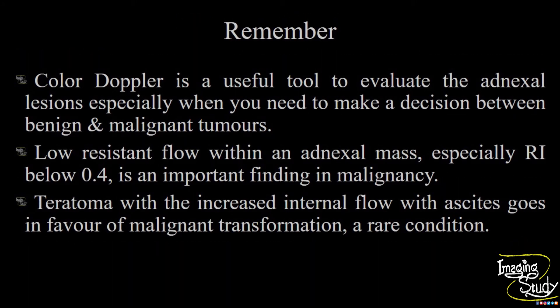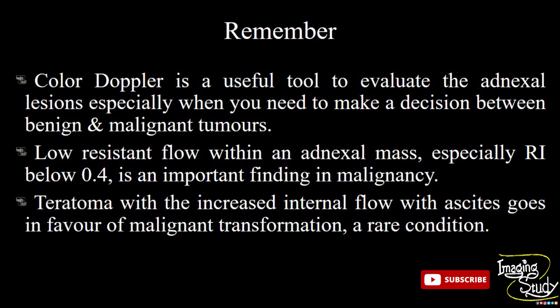The take-home message: Color Doppler is a useful tool to evaluate adnexal lesions, especially when making a decision between benign and malignant tumors. Low-resistance flow within an adnexal mass — especially RI below 0.4 — is an important finding in malignancy. Teratoma with increased internal flow and ascites goes in favor of malignant transformation, which is actually a rare condition.